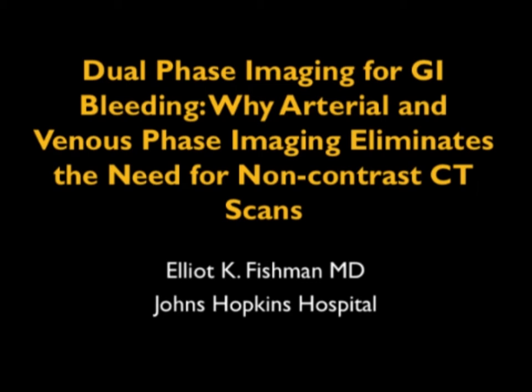This is on CT for GI bleeding. And what I'm going to speak to you about is a little bit of protocols, why I think arterial and venous phase imaging are ideal. If you look at some of the original articles, people suggested non-contrast and arterial. I think the way we do it is indeed better, and I'll go through it with you.